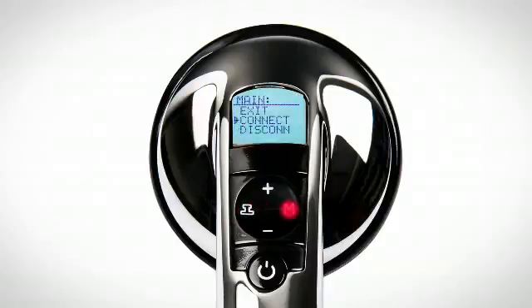Operational settings can be changed by pressing the M button. Use the plus and minus buttons to scroll and the M button to select your option. Use the filter button as the escape key.